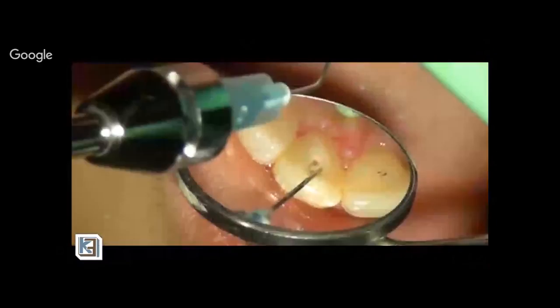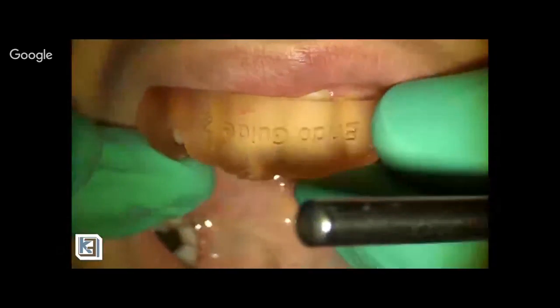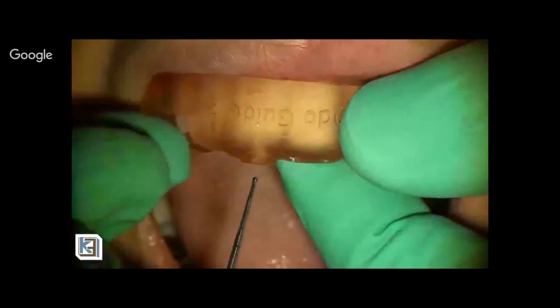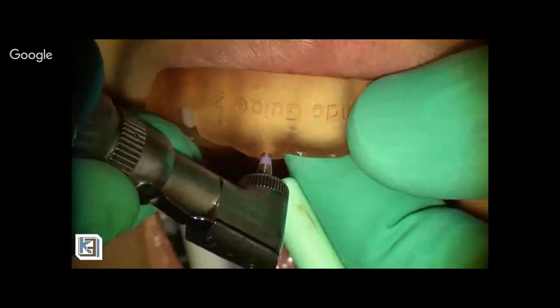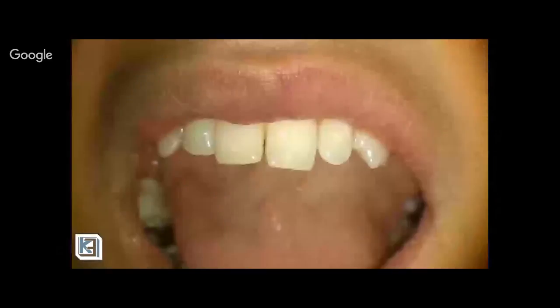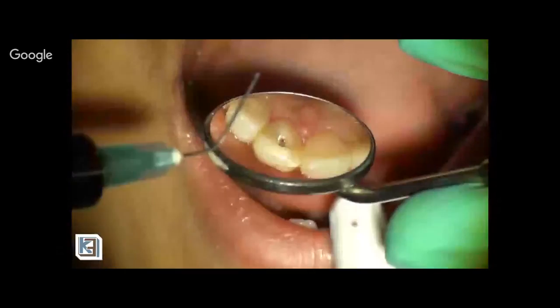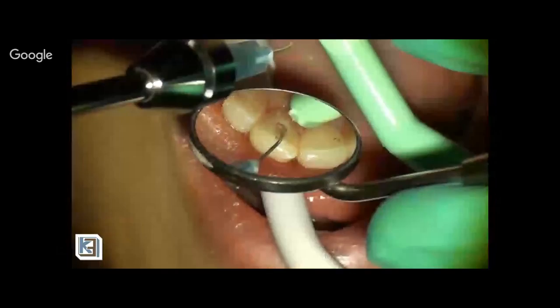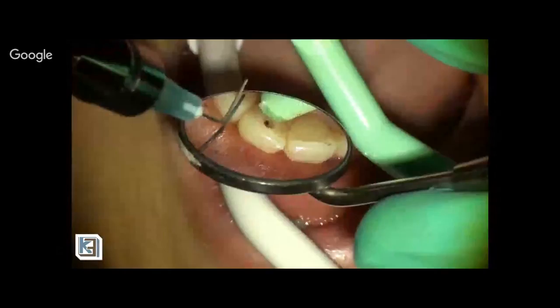But what I did, I went in and I actually rebuilt the entire central portion of the tooth with composite to strengthen the tooth and make up for all the lost structure. That composite in the center will not only restore the tooth to its normal, not normal, but at least strengthen that cervical area of the tooth, but also will allow for my drills to be centered all through the process. And as I drill through the composite, the planes or the walls of the drilled area will act as an internal guide of my drill as well.